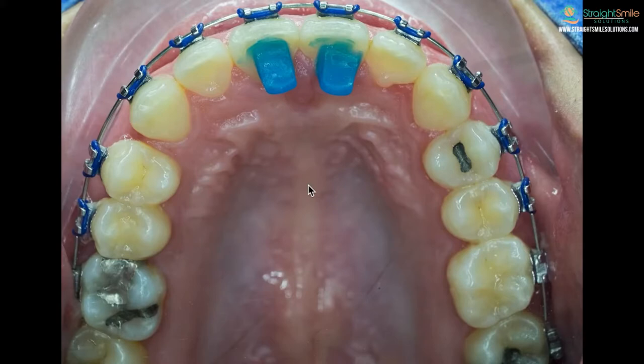Sometimes you're going to have your bite bumps on your front teeth, sometimes on your back teeth — they may be on the top, the bottom, or even on your canines. It really depends on the personal preference of the doctor and what they're trying to accomplish. The number one reason people put them on is to prevent patients from biting down on their bottom brackets.